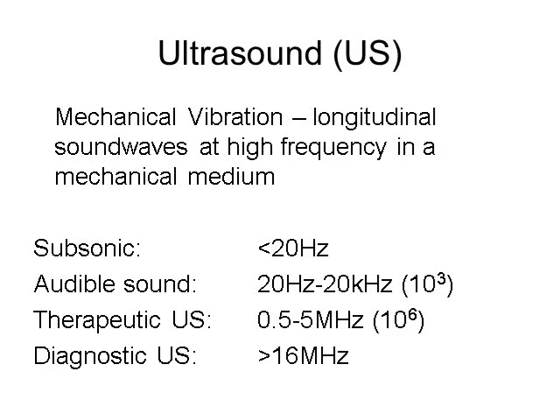Ultrasound is effectively mechanical vibration applied to the body at high frequencies. These figures demonstrate where therapeutic ultrasound lies in the frequency spectrum. Audible sound is between 20 Hz and 20 kHz, or 20,000 pulses per second. Therapeutic ultrasound is between 0.5 and 5 MHz. Diagnostic ultrasound used in, for example, prenatal care uses much higher frequencies, and the objective here is to measure the reflected energy.